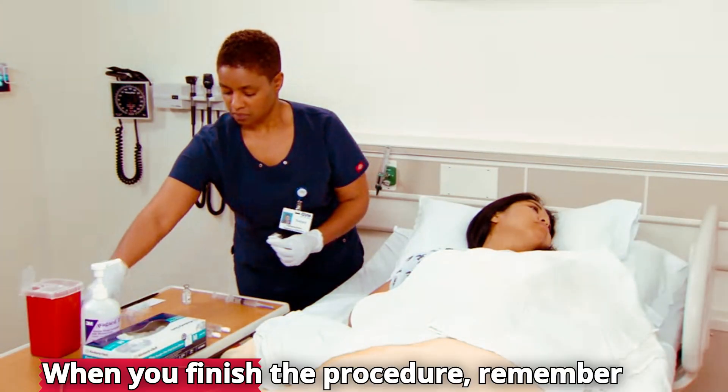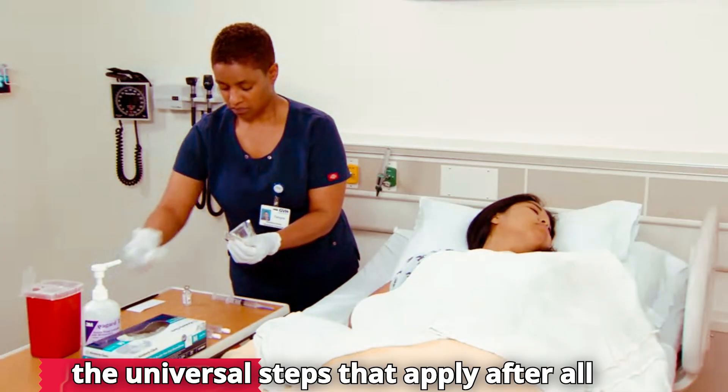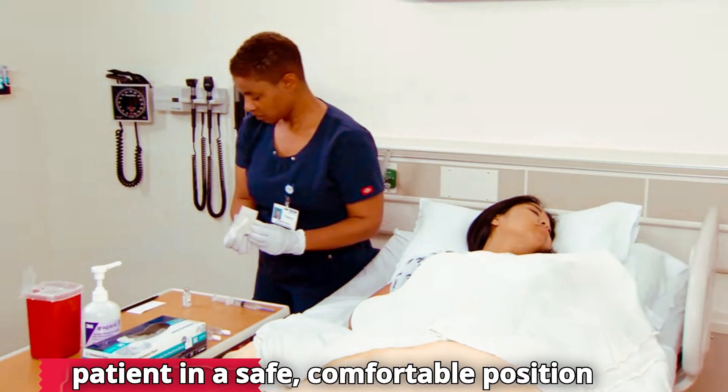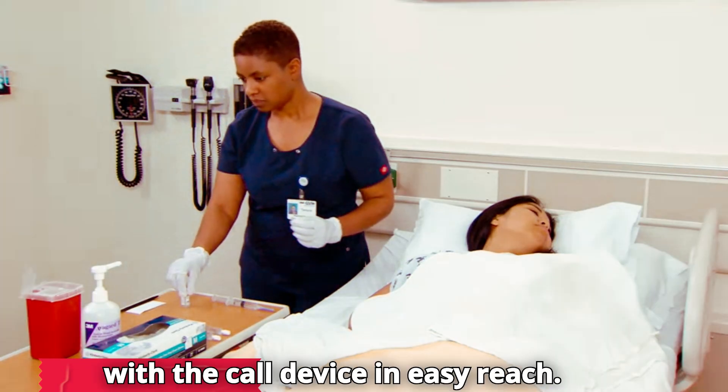When you finish the procedure, remember the universal steps that apply after all procedures. For example, leave the patient in a safe, comfortable position with a call device in easy reach.